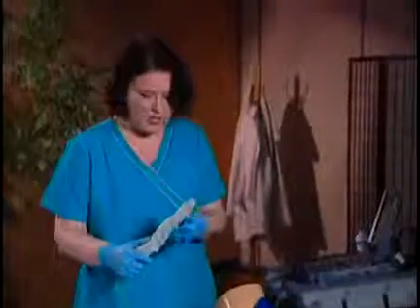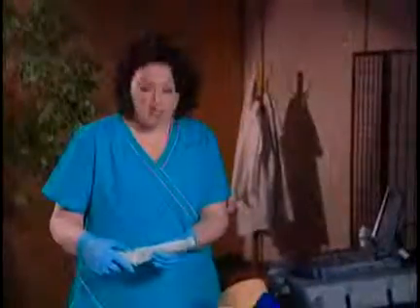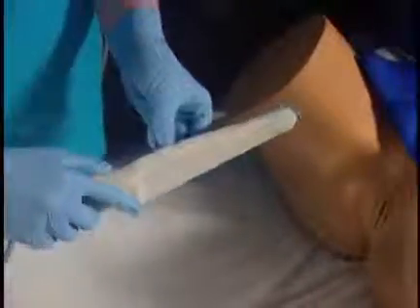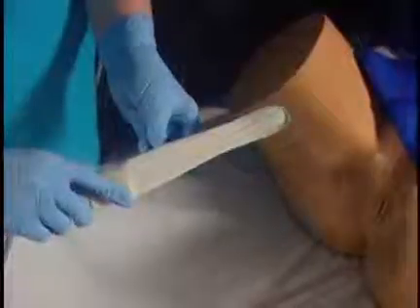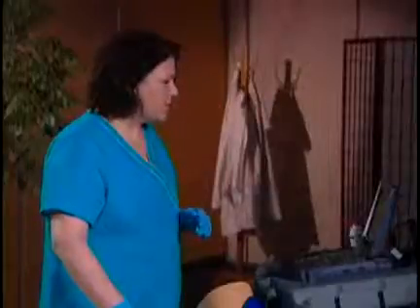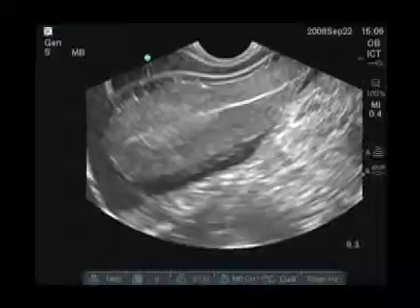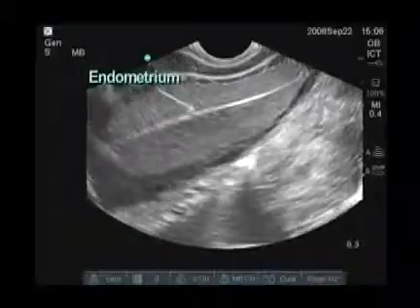And again, your orientation for this examination is very important. So for the long axis or sagittal view, we want the orientation marker up. And then when we go to the coronal view, we're going to turn that so it faces the patient's right. After we've inserted the transducer in a long axis view, the first thing that we're going to see is a long axis of the uterus. In this phantom representation of the uterus, we see an endometrial stripe, which is represented by the white line.